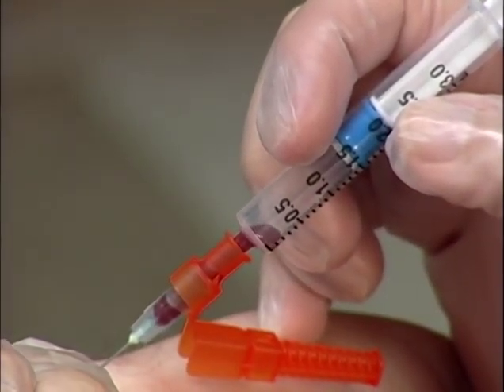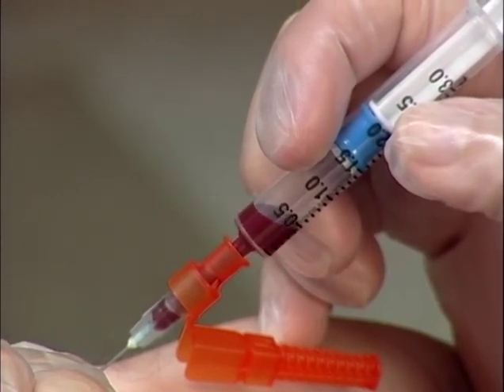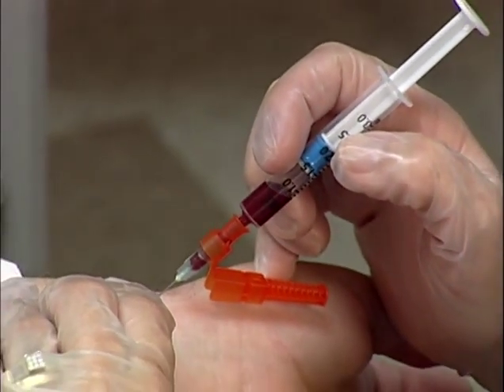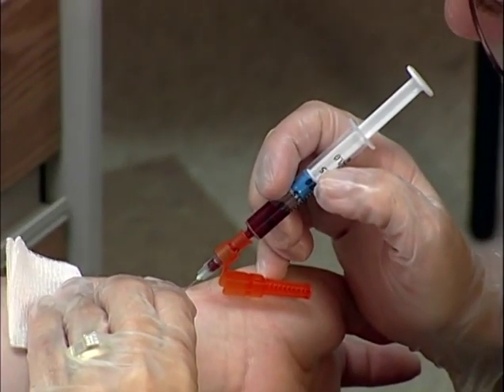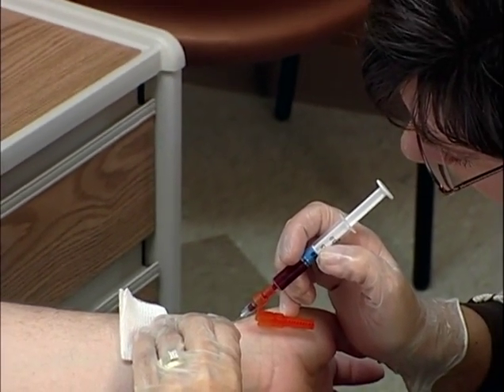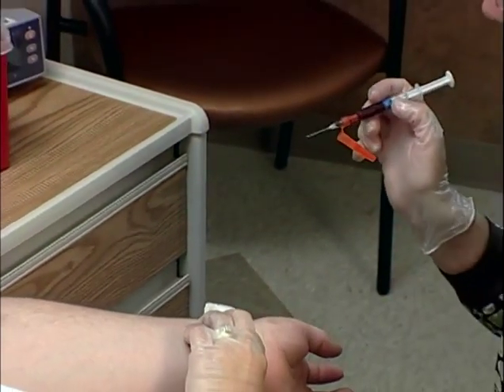When entered, blood will spontaneously flow into the syringe. While filling, maintain precise needle placement. Observe for an uninterrupted flow into the syringe. Terminate the draw if a hematoma develops. Allow the syringe to fill until a sufficient sample has been obtained.